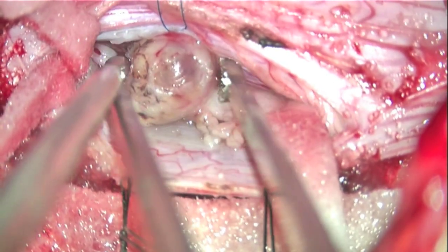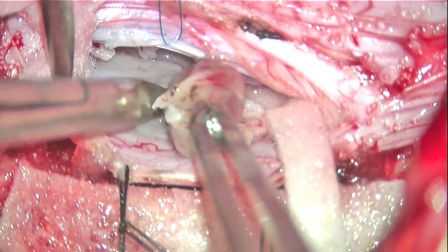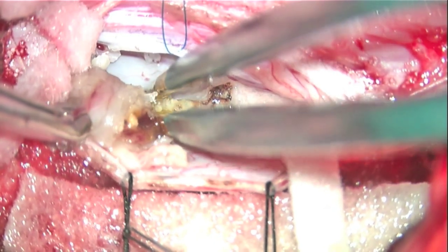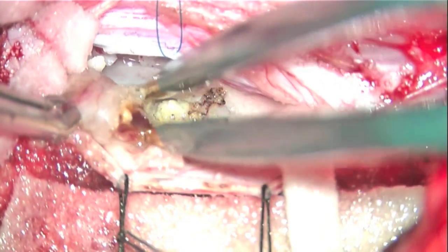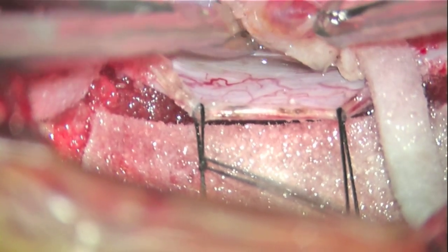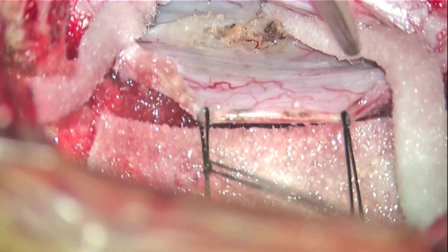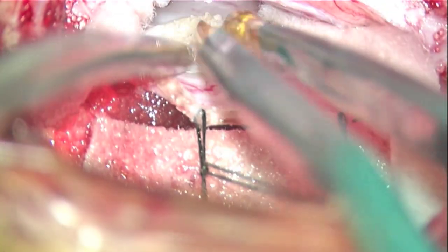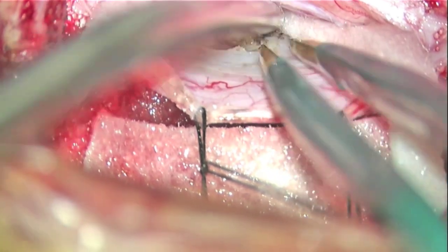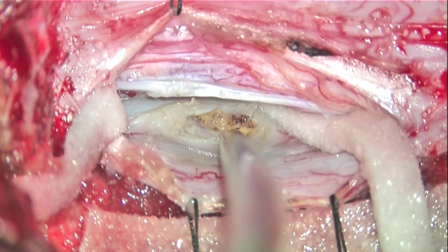Gentle traction mobilizes the tumor laterally to identify remaining lateral intradural tumor margin attachments, which are systematically cauterized and divided to allow removal of the remaining intradural component of the tumor. The C4 dural root sleeve is now clearly seen, as is the medial aspect of the extradural tumor component. This is carefully cauterized.